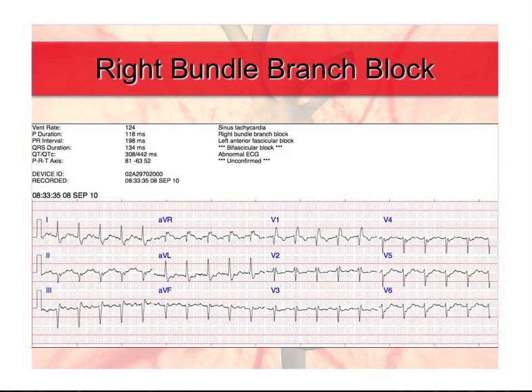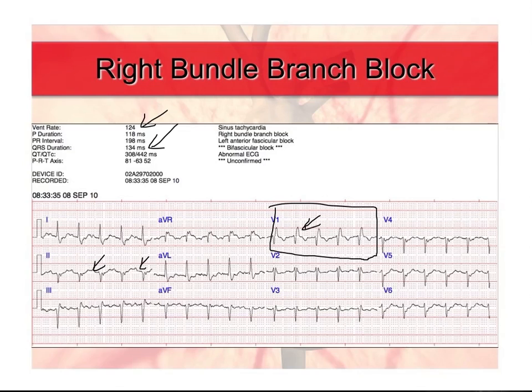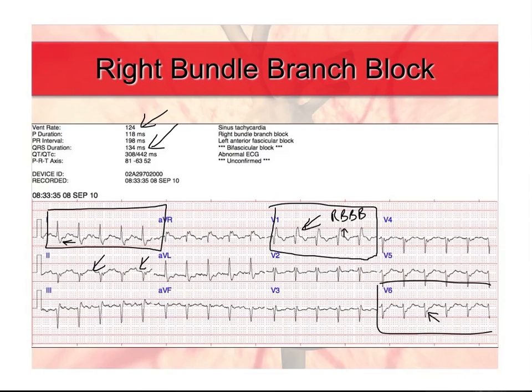Let's look at another example. Again it's wide — QRS duration 134 milliseconds. We see P waves with every QRS complex, confirming a supraventricular rhythm. Looking at V1, the last wave is certainly upright, indicative of a right bundle branch block. Looking at lead 1 and V6, we have a terminal S wave in both leads. That is also indicative of a right bundle branch block.